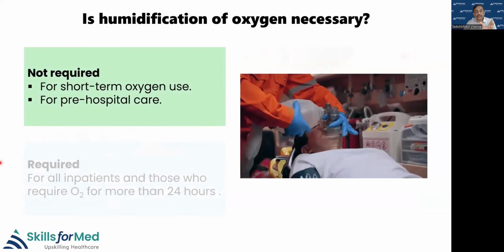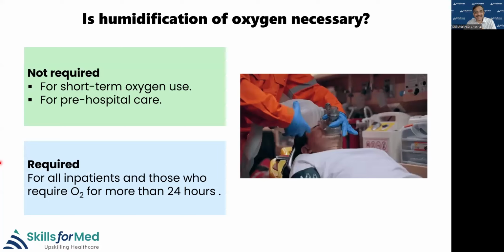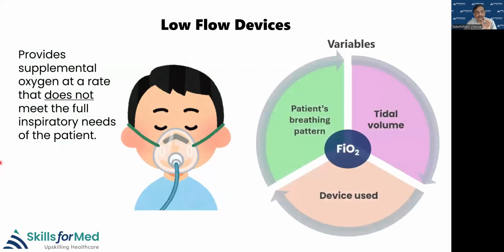The next question I asked is: is humidification of oxygen necessary? It is not necessary for short-term use. If you are using it for just a few hours, mostly in ambulances, it is not necessary to humidify oxygen. But for all inpatients who are going to stay for more than 24 hours, it is a must to humidify the oxygen. This again is the guideline which you have to know.